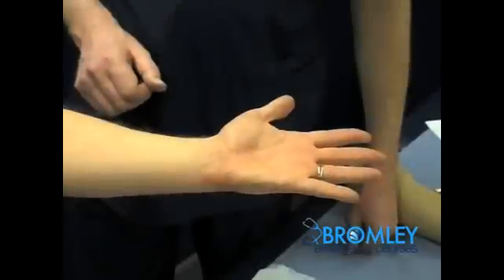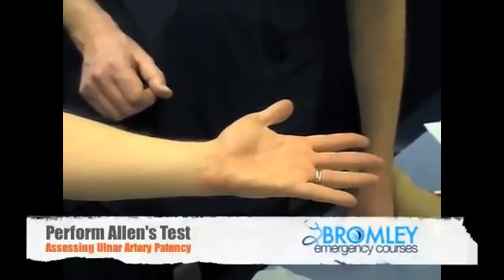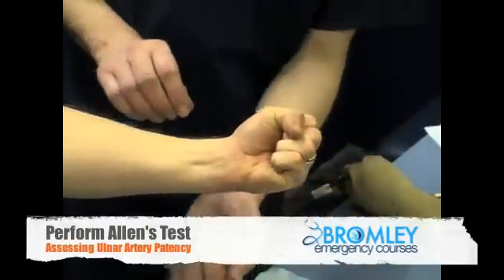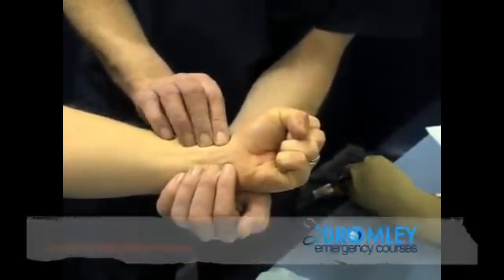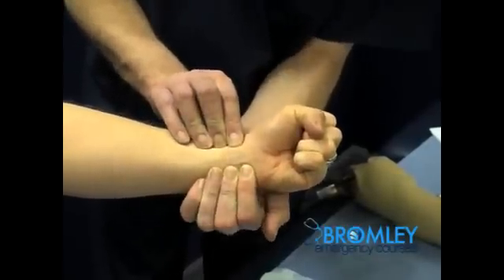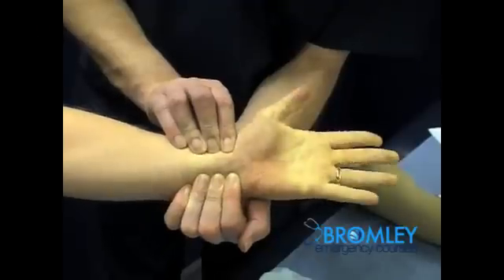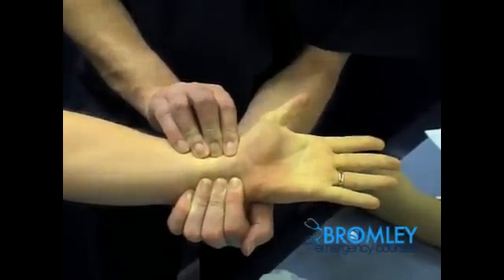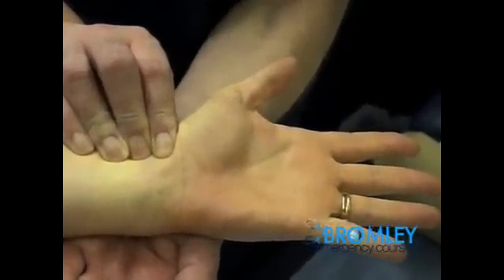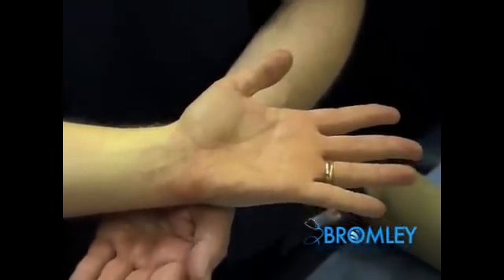Before we undertake a blood gas sample from a radial artery, we undertake an Allen's test. In this, the patient first of all makes a tight grip in order to squeeze blood out of the surface capillaries, and then we apply pressure both to the ulnar and to the radial arteries. Once we have done that, we then ask the patient to open the hand, and we see that there is no blood in the capillaries. We then release the ulnar artery to see the blood coming back, to check that the ulnar artery will be patent, as demonstrated here.